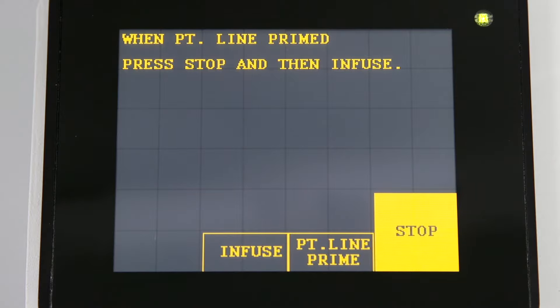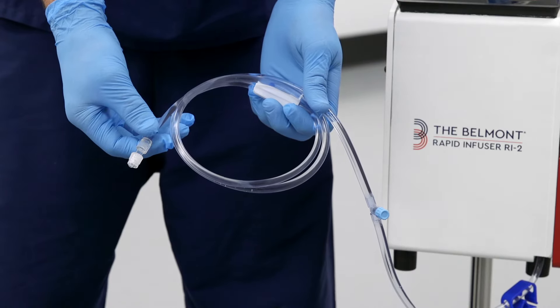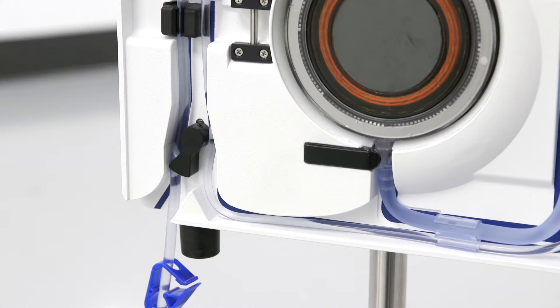The system automatically enters a standby mode until you are ready to connect to the patient's catheter. Before continuing, please inspect and make certain that the patient line is completely primed and free of air. Any air bubbles after the patient's safety valve wand must be removed prior to patient connection.